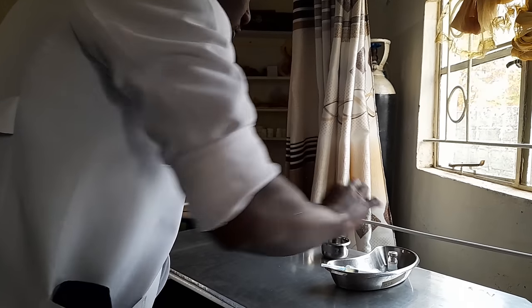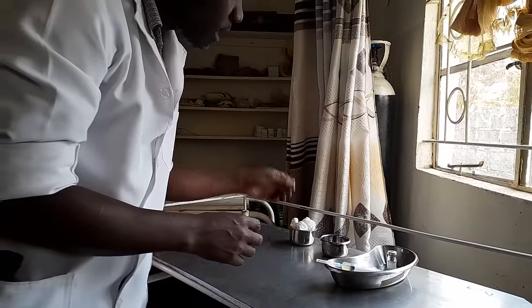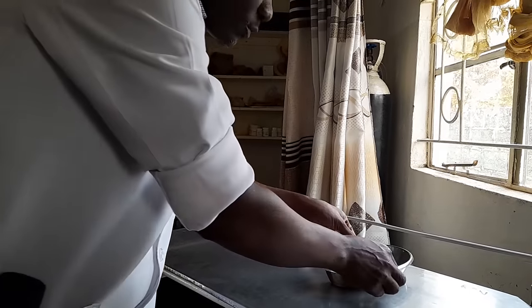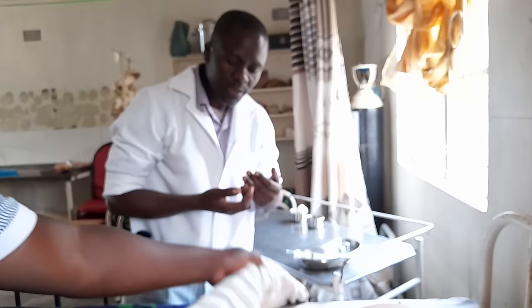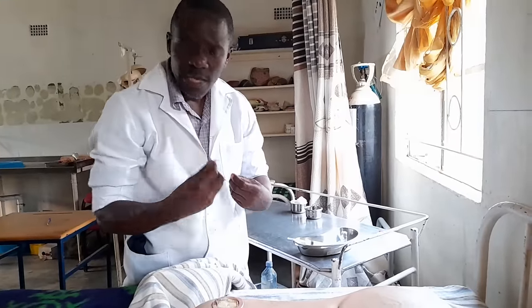Put one or two spirited swabs and don't forget a dry swab. Move the tray close to the patient. Since the assistant is exposing the injection site, I have to verify the patient's identity again: 'Sir, what did you say your name is?' He has said again it is Mr. Luwoya. So I have verified once more — now I can go ahead and inject.